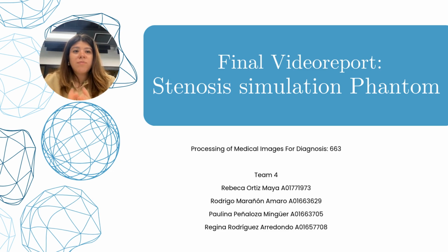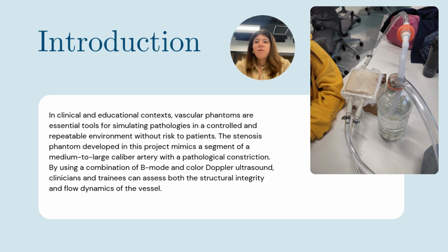Hi, we are team number 4 and we're presenting our final report, Stenosis Simulation Phantom. This work focuses on the development of a vascular phantom especially designed to simulate arterial stenosis.